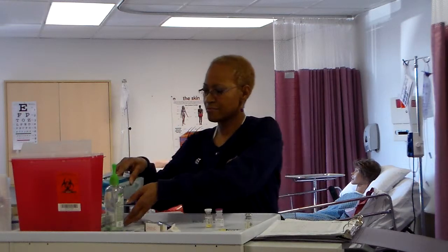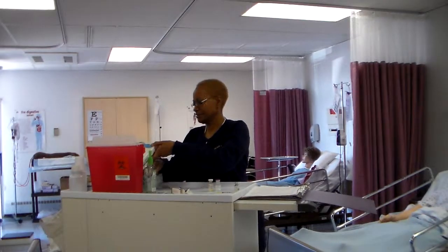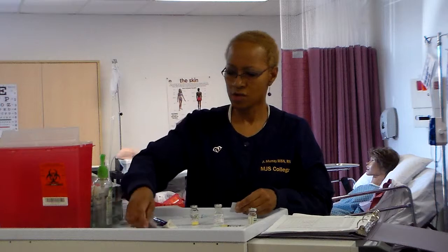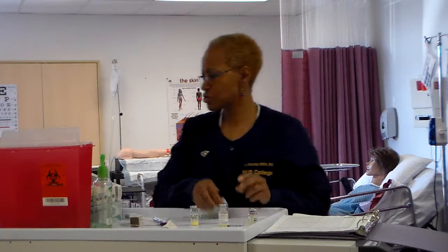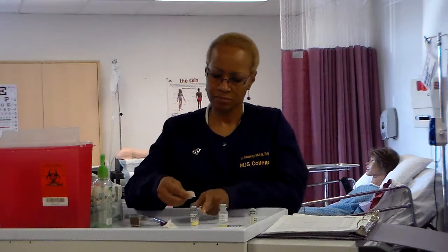Remove cap covering vial of powdered medication and cap covering vial of proper diluent. Firmly swab both seals with alcohol swab and allow to dry. Okay. So your cap of your medication, the cap of your diluent, and even though we think, oh, that should be sterile, you still have to swab it off. Each of them. And this, I suggest you do them both at the same time. Do a good scrub. And allow them to air dry.